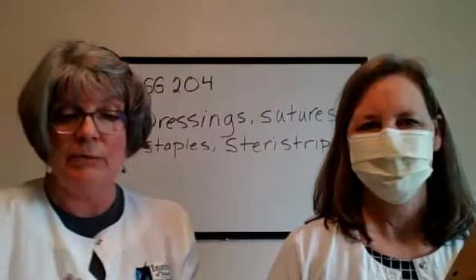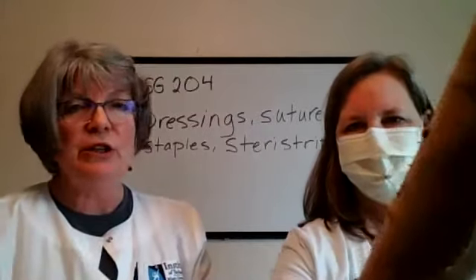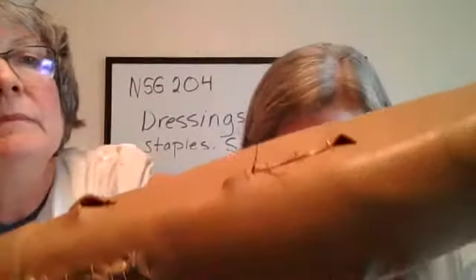So these are the scissors. There's a little hook. You can see that little hook right there on the blades. That is hugely important because when you are starting to take a suture out, what you will do is, I'm trying to make it seeable.